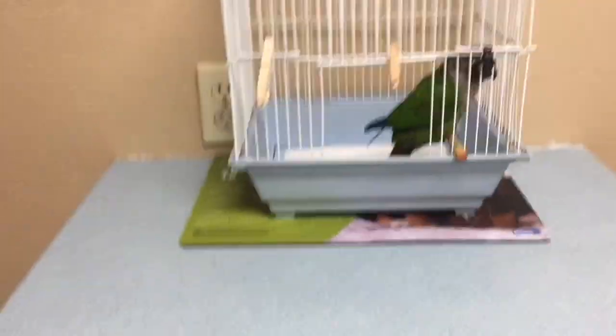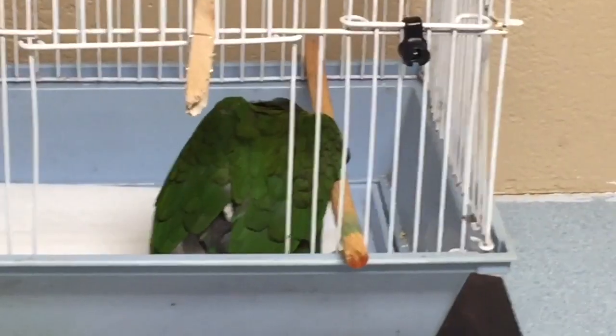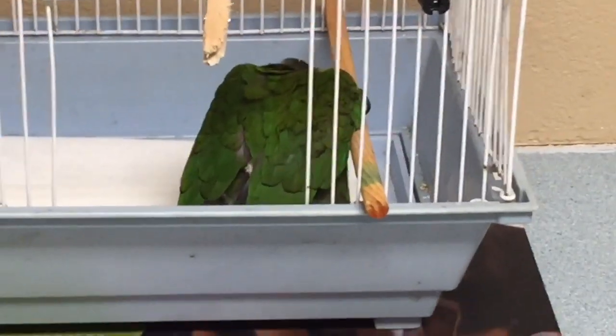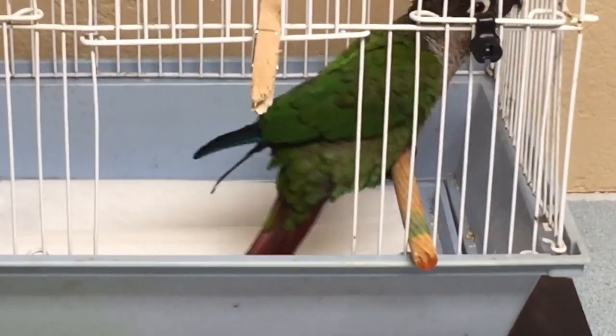This is kind of like old, old medicine — the fact that this was how they used to fix broken legs in dogs and cats before the invention of externals and all that new and cool technology. It turns out that they don't make these for birds — I had to make that one myself, handmade by yours truly. That particular splint has probably fixed about four or five birds over the years.